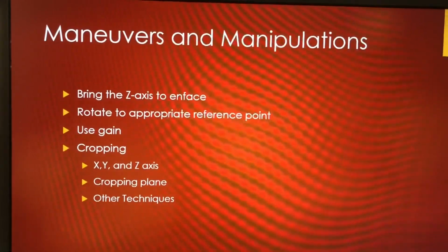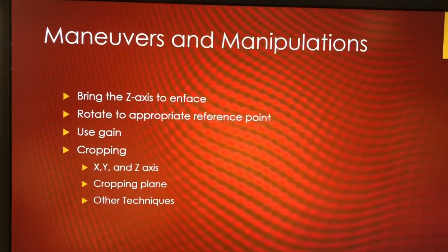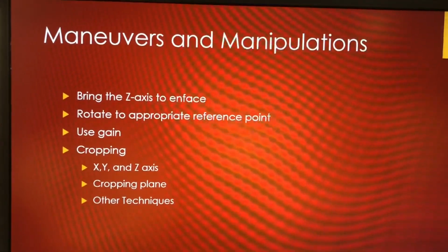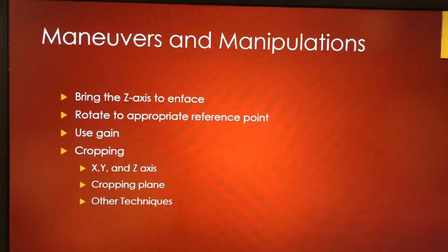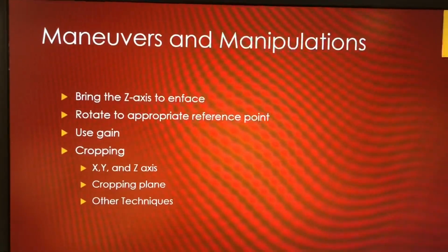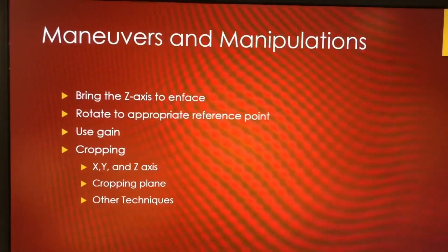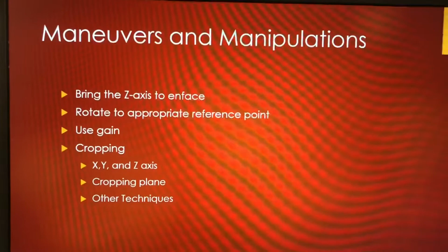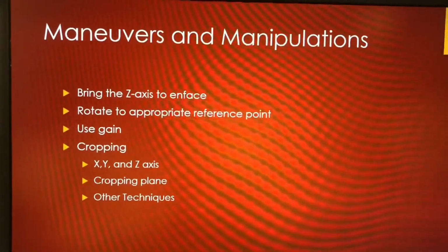So it actually adds quite a bit of enhancement, and any information you get that's accurate just helps, better information helps make better decisions. So that's another tool in our toolbox that helps us get to the finish line where we give good information to the doctor.